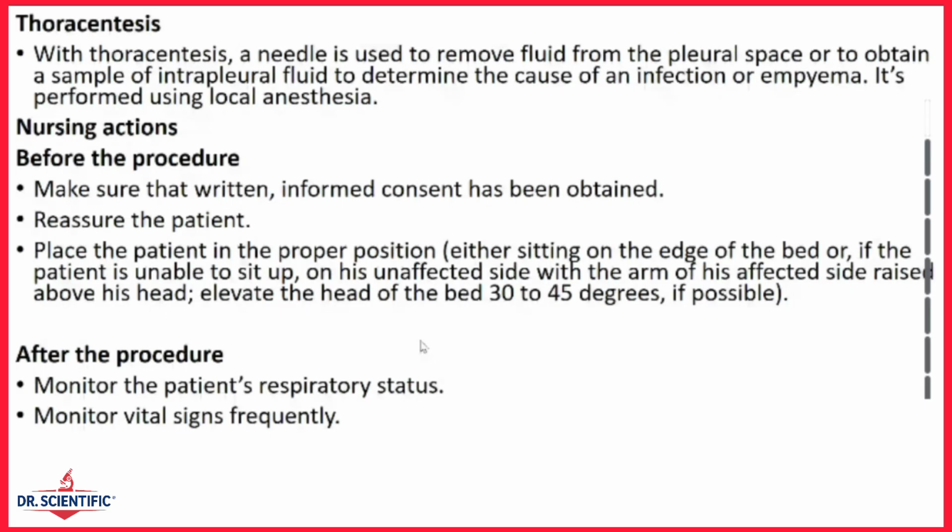Then explain the procedure, position the patient for the procedure, and remove any tight clothing or jewelry that may interfere with the procedure, that preoperative preparation that we mentioned. And this is a sterile procedure, so the personnel doing it must make sure that they maintain a sterile field.